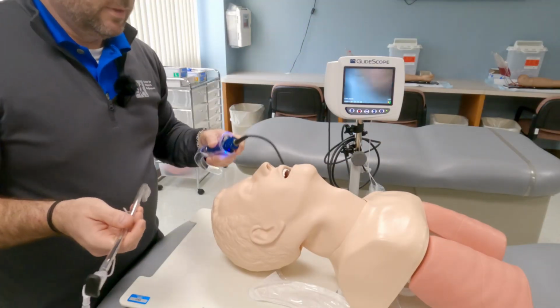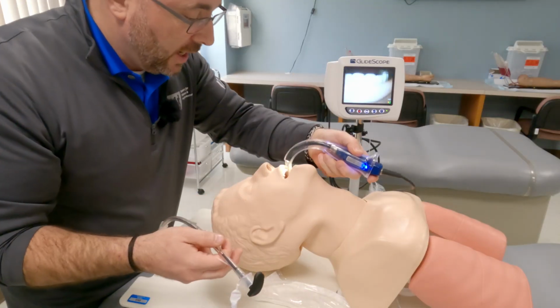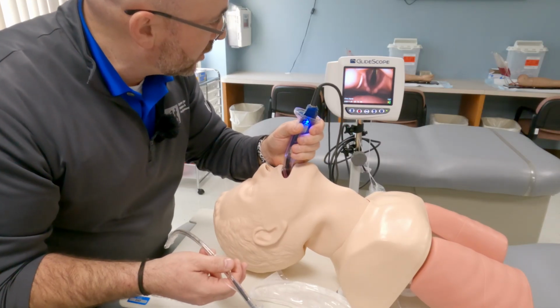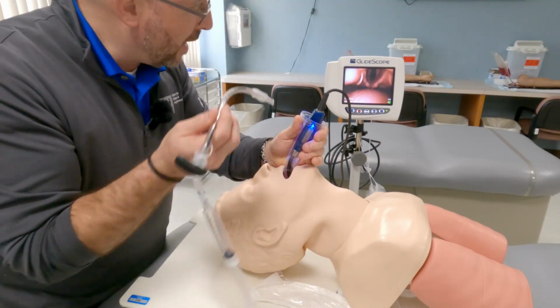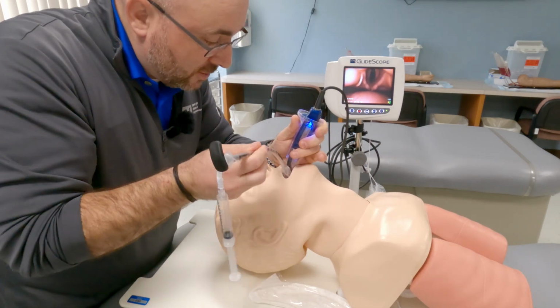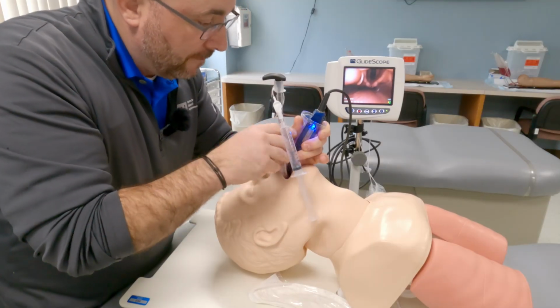So let's just review this again. First of all, I'm looking at the mouth, inserting directly down the center. There's step one, okay? Step two is I'm looking over at the monitor, I find the cords. Step two. Step 3, as I look back at the mouth. So we're going mouth, monitor, mouth, monitor. So mouth, monitor, back to the mouth to insert the endotracheal tube, 90-degree angle, and rotate in.